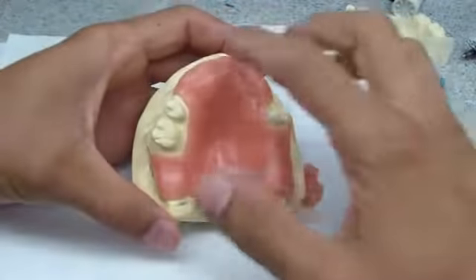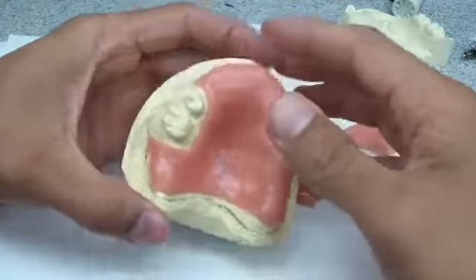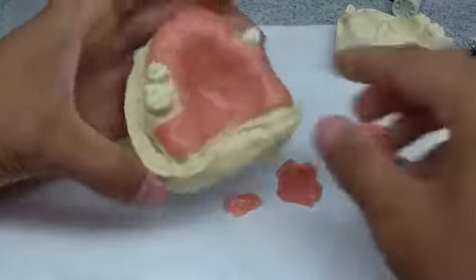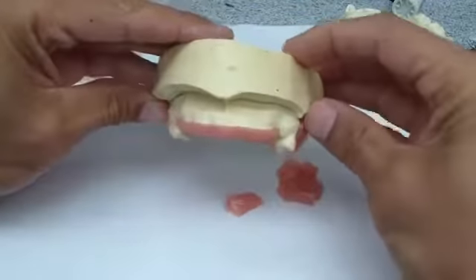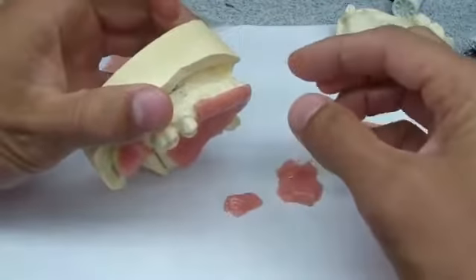Okay, so I placed the base plate material, which is visible light cured, so I just use my 25 blade to remove any of the excess, and we're going to now put this in the light curing oven. You can see now we haven't just captured a little bit of the alveolar ridge, the crest.